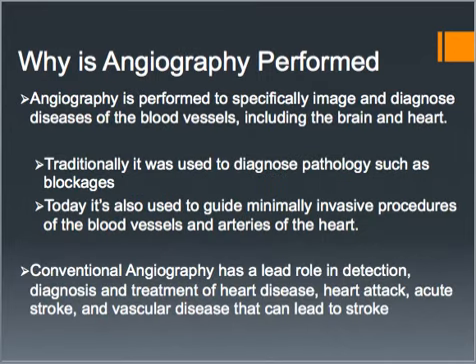So why do we perform angiography? Well, kind of like I just said, so we don't have to have surgery. But X-ray angiography is performed to image or view and then possibly diagnose diseases of the different blood vessels of our body, including the brain and the heart. So in the beginning, angiography was simply just used to diagnose pathology of the vessels, like a blockage, okay? So they were just using it to diagnose.